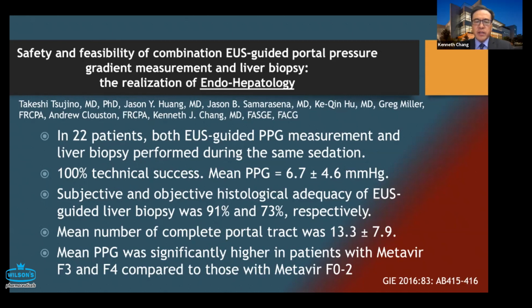And we found that the PPG was significantly higher in patients with Metavir 3 and 4. As a matter of fact, we have a manuscript submitted to Hepatology, and there was an oral presentation at AASLD on US PPG predicting Metavir 3-4 patients even before clinically appreciated.